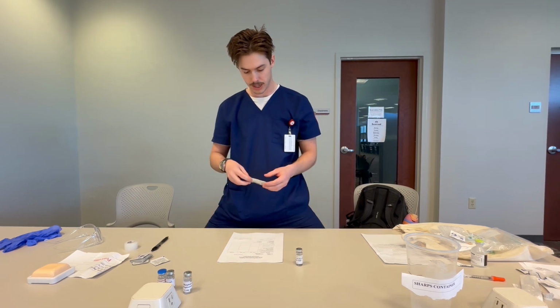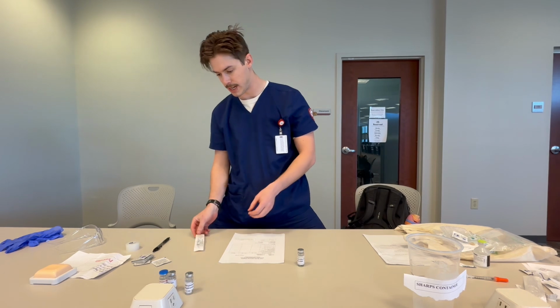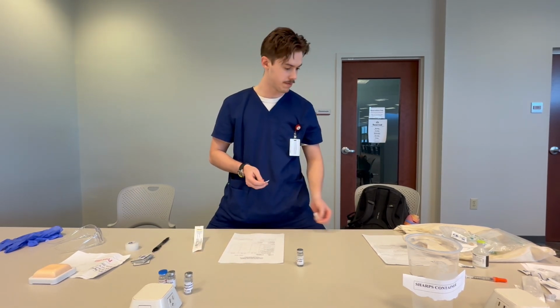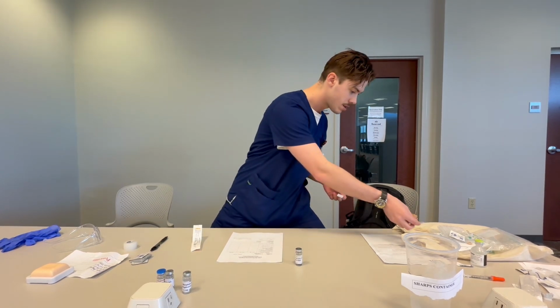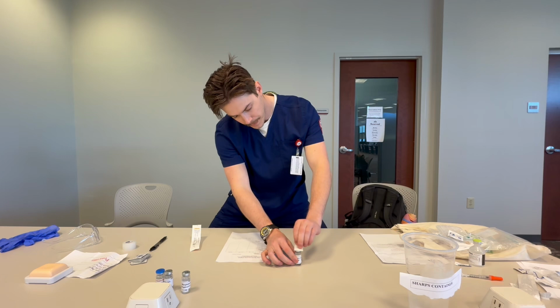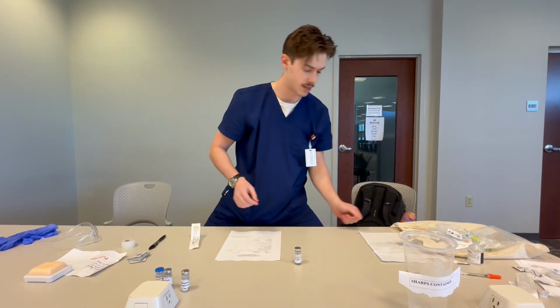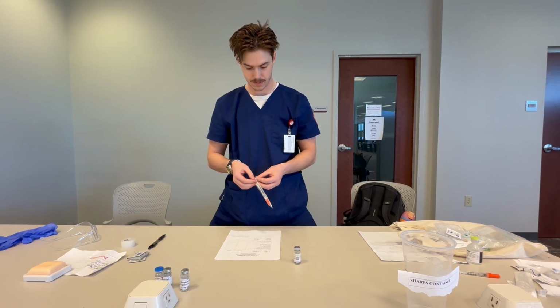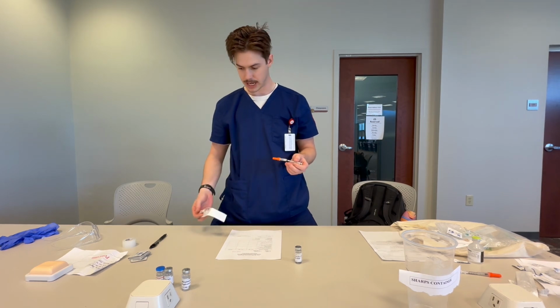So I will start by unwrapping my needle. Actually, before I do that, alcohol swab the drug itself. Don't want him getting any infections on my watch. And now I will begin unwrapping my needle, which I have here.